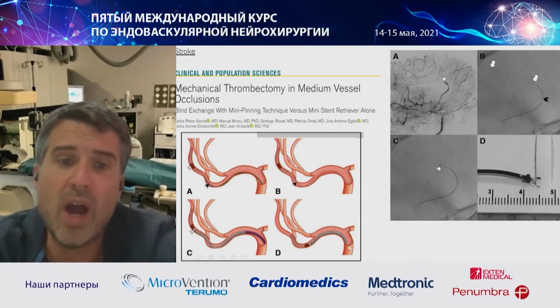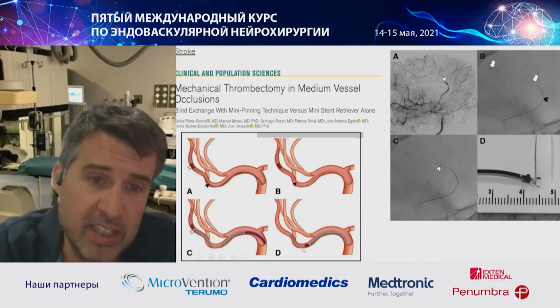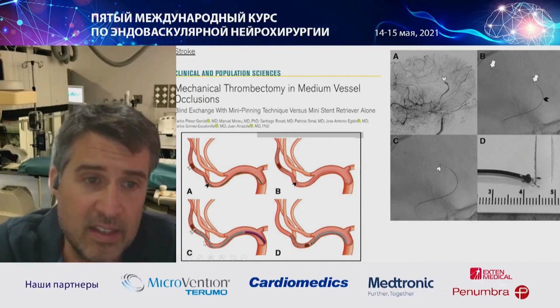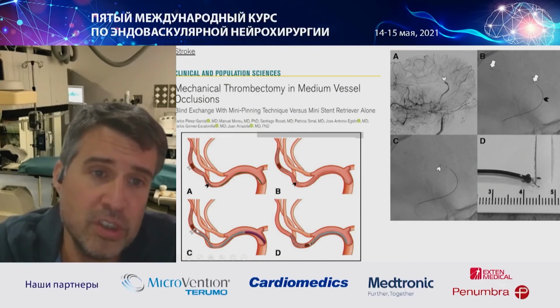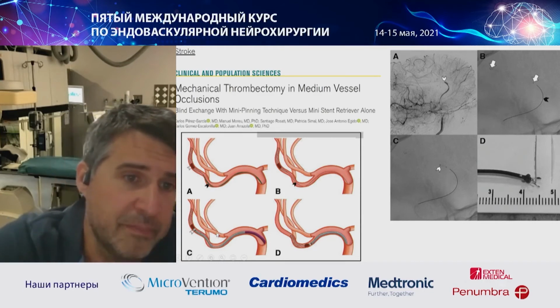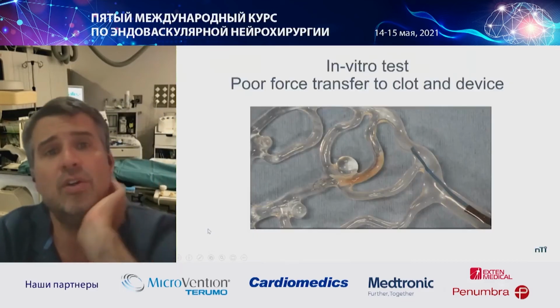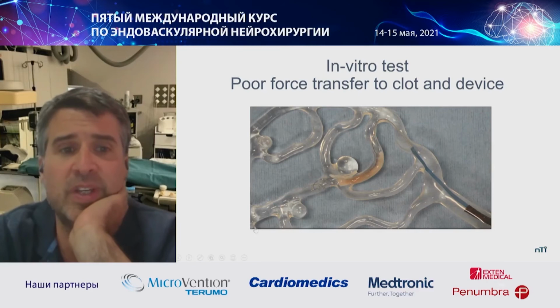And I think it's wise to always combine your stent retriever with a distal access catheter and local aspiration. First, because you protect against distal emboli going to other branches, of course. This is the first reason. But the second reason is the one that I'm showing in this video.